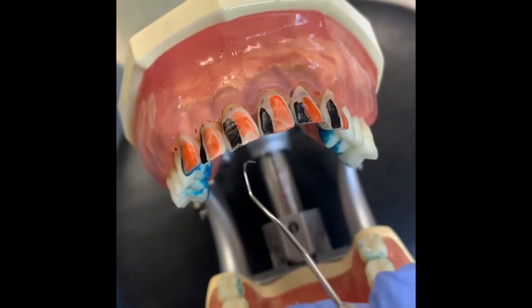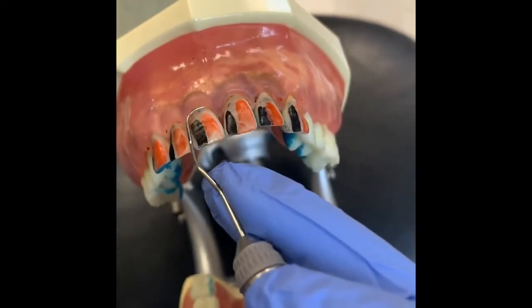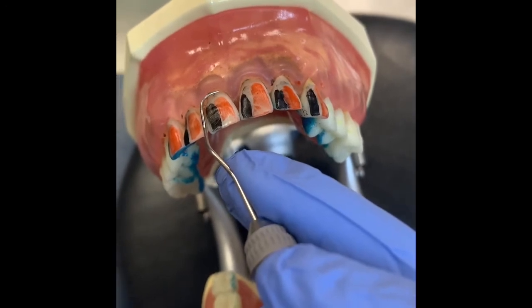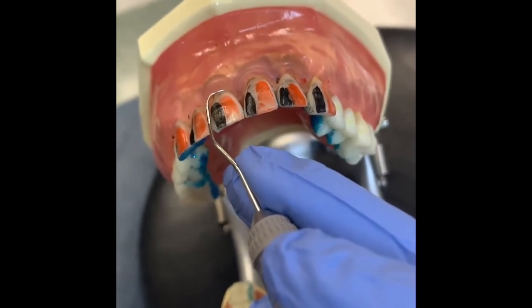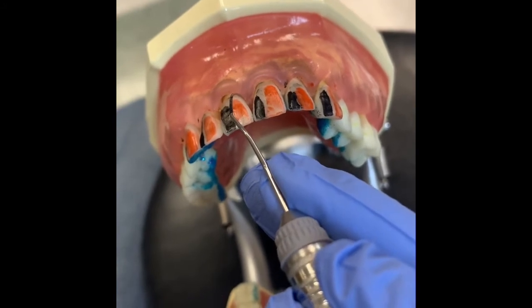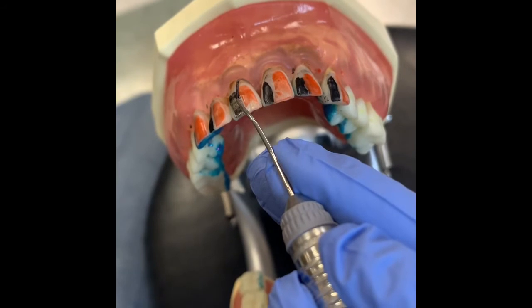Now, if I flip my instrument over, use the other end, you can see how the tip is now into the tooth. It's hugging the tooth. The instrument is adapted to the tooth. This is the correct working end, okay? See, even if I come across into the mesial aspect, you can see how it's wrapping around the tooth. The working end is wrapping around the tooth really nice.